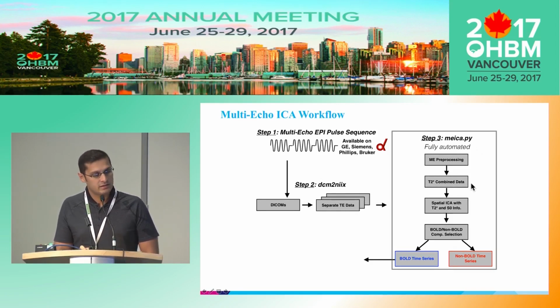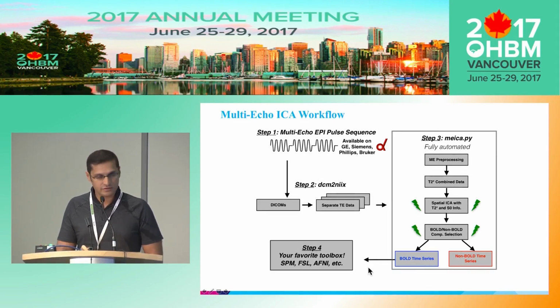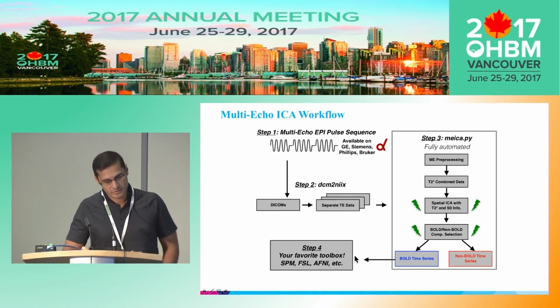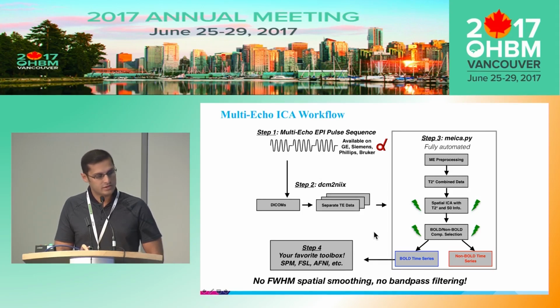Multi-echo preprocessing, it does the T2 star weighted combination, it does a spatial ICA incorporating the T2 star and S0 info, it does the component selection, and then spits out time series. Then you can take your BOLD time series and feed it into your favorite toolbox. We've tried to automate this as much as possible. All that being said, it's important to look at your data, as all the other speakers have mentioned. So I'll go through the outputs in just a second.